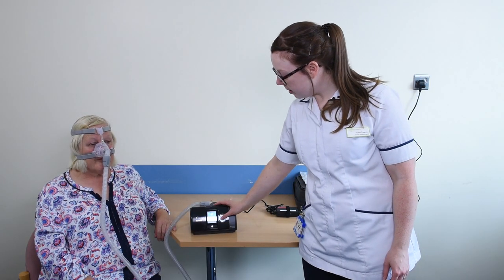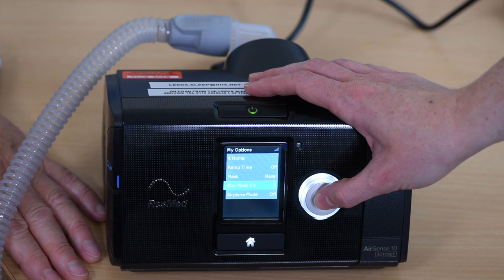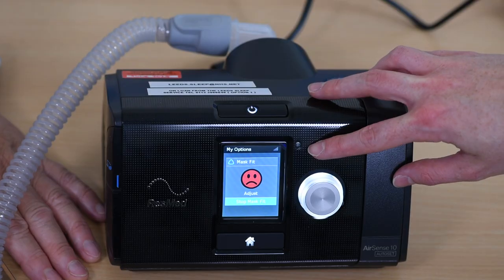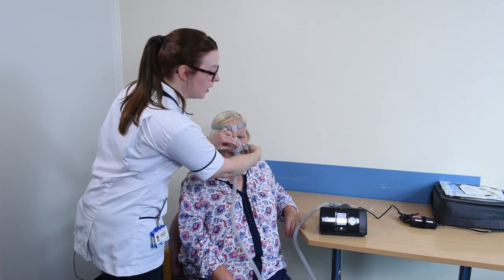If you are struggling with your mask fit, you can go into the 'My Options' menu on your machine, scroll down to 'Run Mask Fit', and this will give you feedback as to how good your mask fit is. If your mask is not fitting well, the face will turn red. In the first instance, adjust the velcro on your straps, being careful not to over-tighten them.